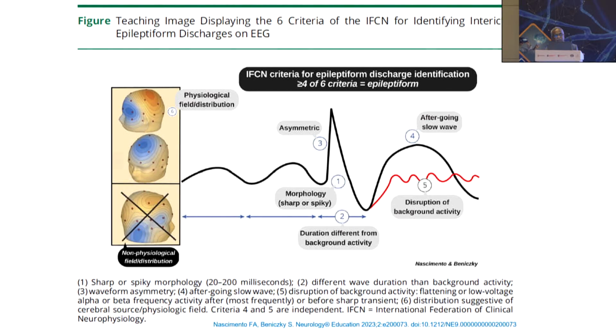The third one is that they are more often biphasic, with an upstroke and a downstroke, and that should not be symmetric. For example, you can see that the downstroke here is slanting. If it is drawn straight up and down, that's most likely an artifact. You saw some needle-like myogenic potentials or muscle spicules and those kinds of things. But here it should be asymmetric. That is the third one.